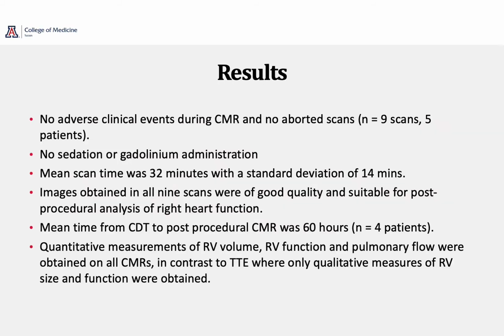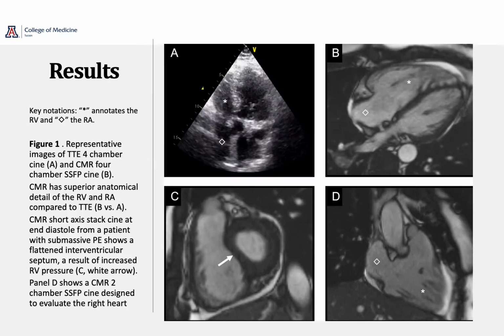And our results included no adverse clinical events or aborted scans. We didn't need to use any sedation or contrast. Mean scan time was a little high at 32 minutes. Goal would be, as we perfect this system, to cut that down to less than 20 minutes. The scans themselves were obtained with good quality images.